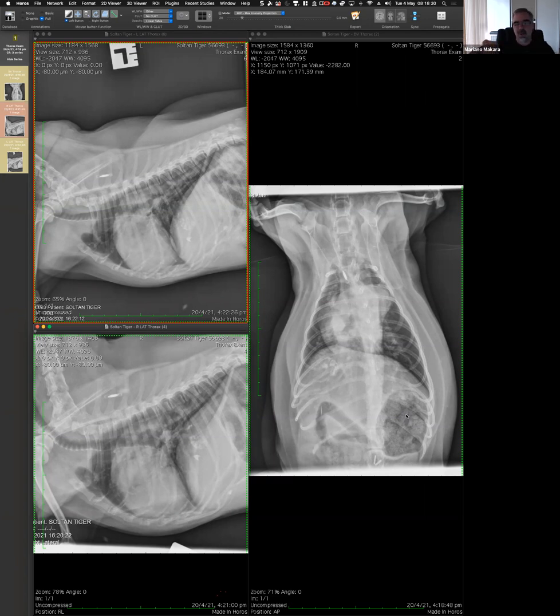Then we can discuss, based on details, what's the most likely differential. And having that very basic approach can also help you deal with a case. If there's a severe pneumothorax, well, it's in the pleural space, I better put a needle in there, remove it, and I'm going to be helping the animal with that. Or maybe let's do the opposite. If it's severe pleural effusion and I have the ability to identify that to the pleural space compared to a severe change in the lung, then one needs a needle, the other one doesn't. Makes sense? So that big thinking in groups, in lesion localization, I love it. It's perfect. And sometimes you need to go back to those big groups.